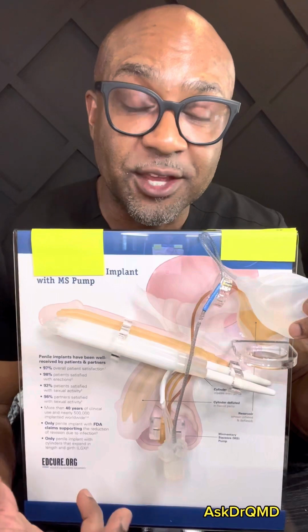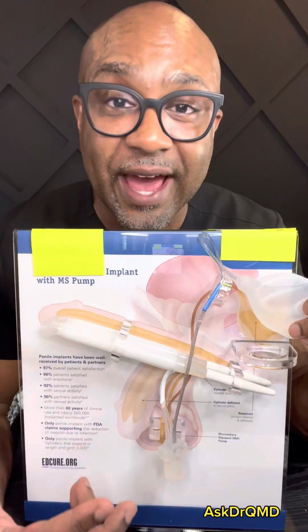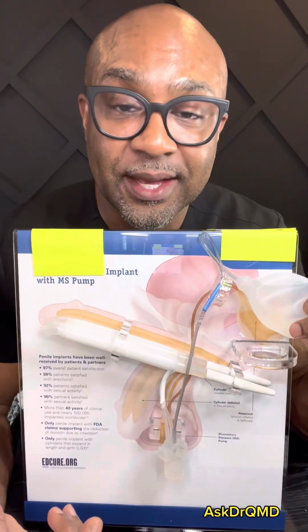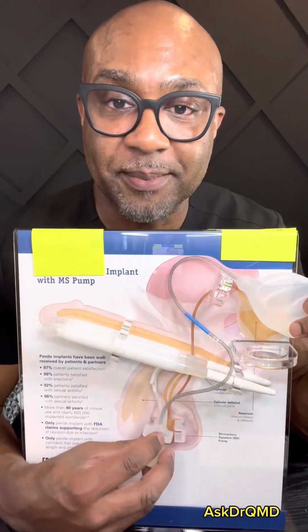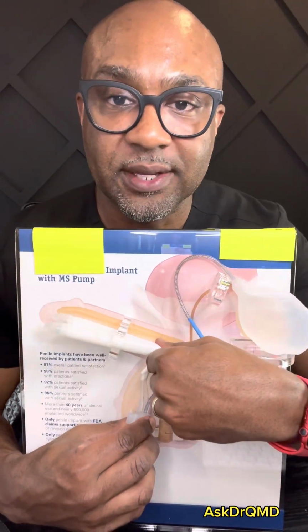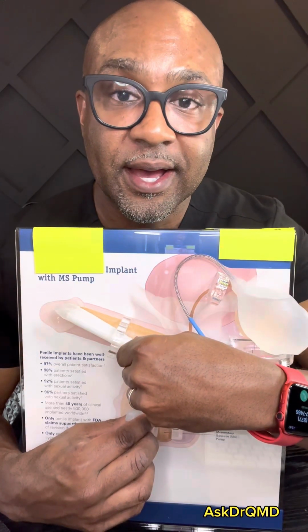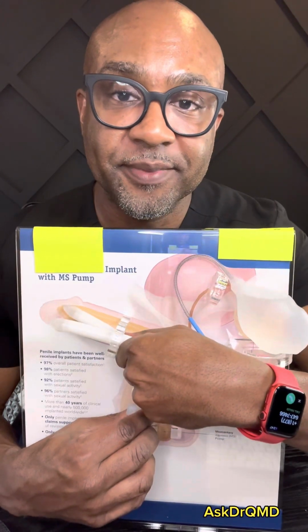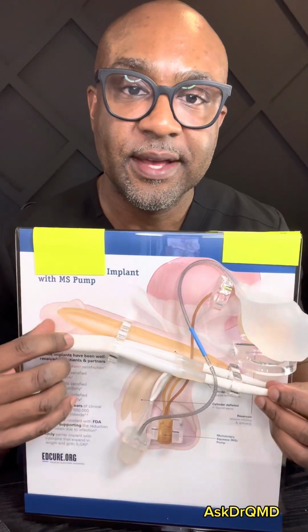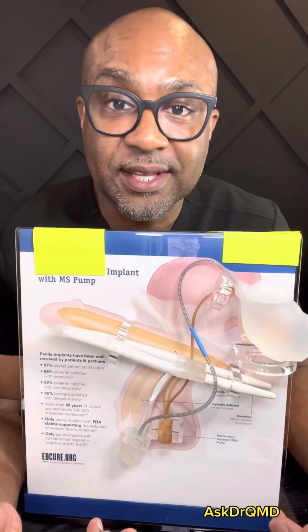And the beauty about this is that you have the sensation, you can have an orgasm, you can have ejaculation, everything is intact. The only difference is you won't go down after you have an orgasm. So you actually have to hit this button that we talked about right here. You press this button and you give the prosthetic a little squeeze, and the fluid actually goes back into the reservoir. And then that will complete the cycle. It's going to take a little while, but you get the gist. And so now you have it in its flaccid state at this point. So that is a three-piece penile prosthesis in general.